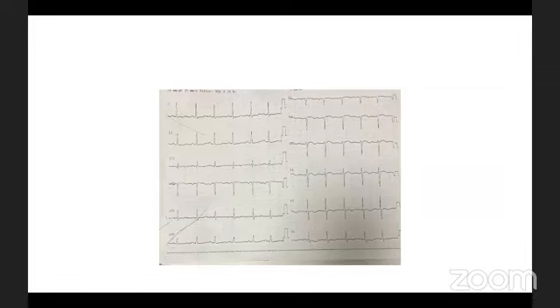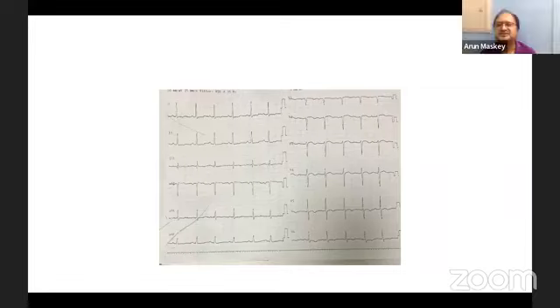And what is the comorbidity of the patient? No risk factor, 49 years. Any echo available there? Yeah, we did an echo. Everything was clear, some degree of hypokinesia, which is not recorded. I cannot see it.